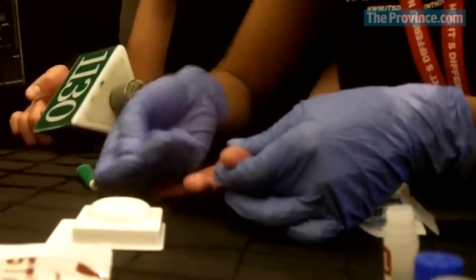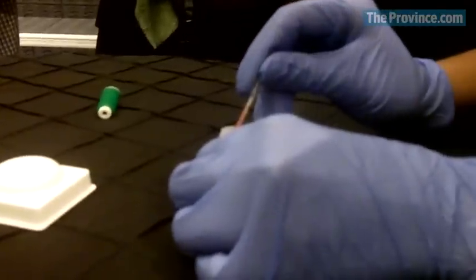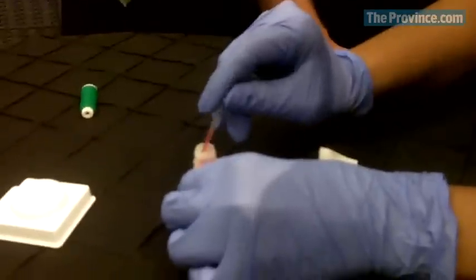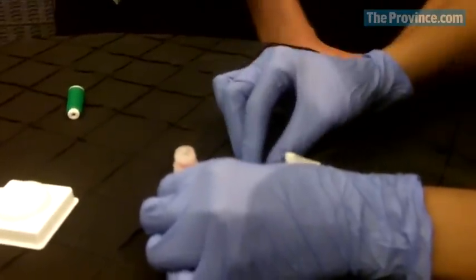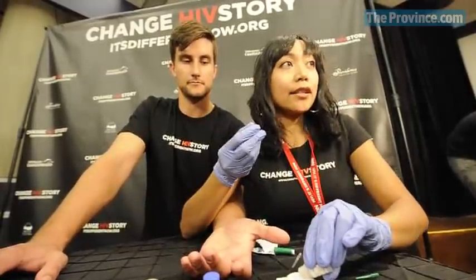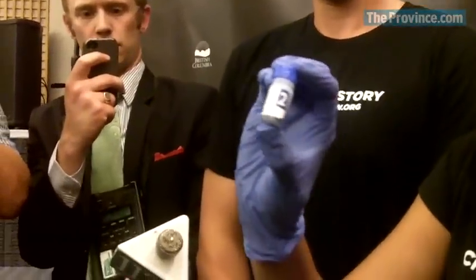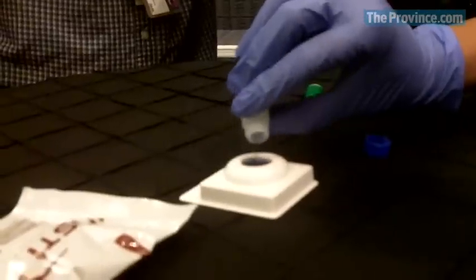I would just press it on his finger and get a sample of blood by squeezing his finger. I take the blood sample and squeeze the entire contents into bottle number one, and then pour the entire contents into the testing membrane, and then it follows with bottle number two, pouring the entire contents into there.